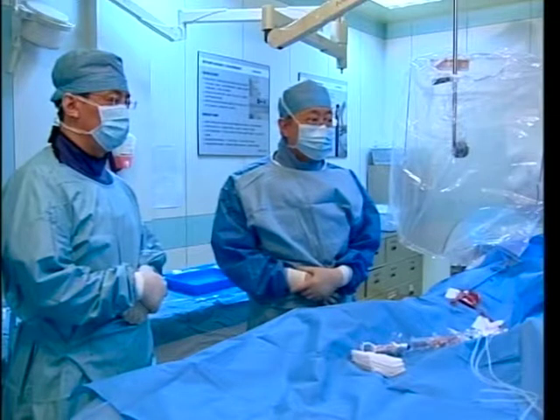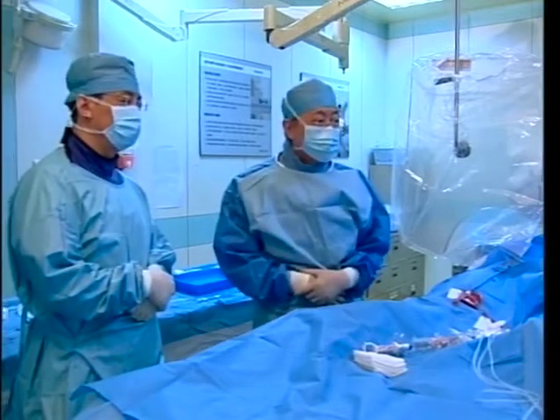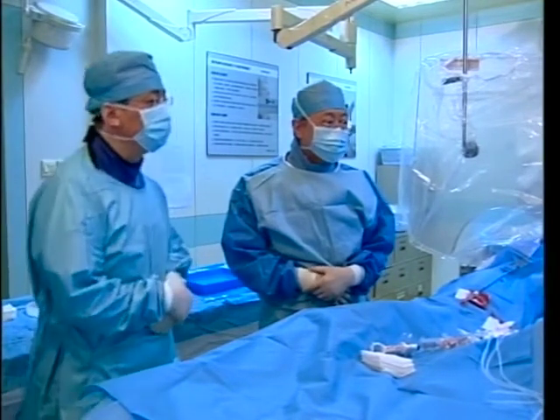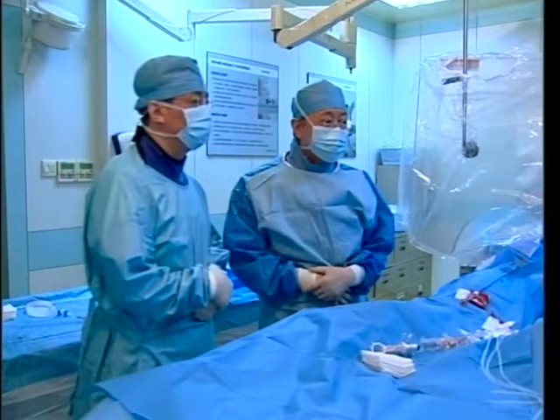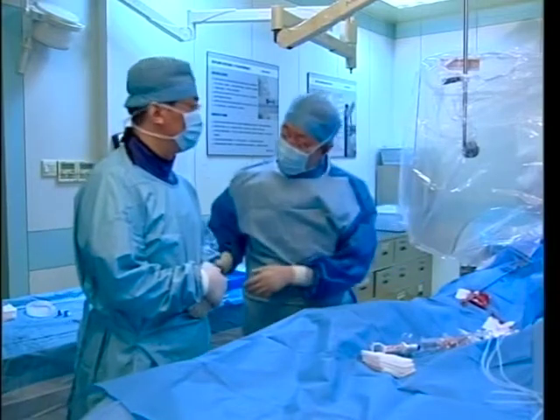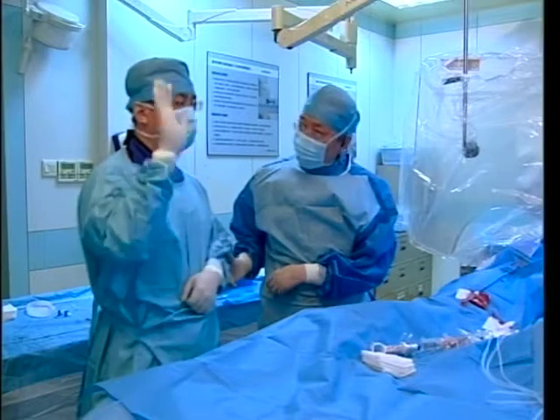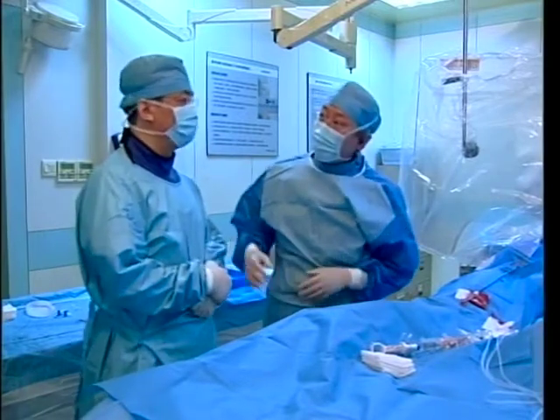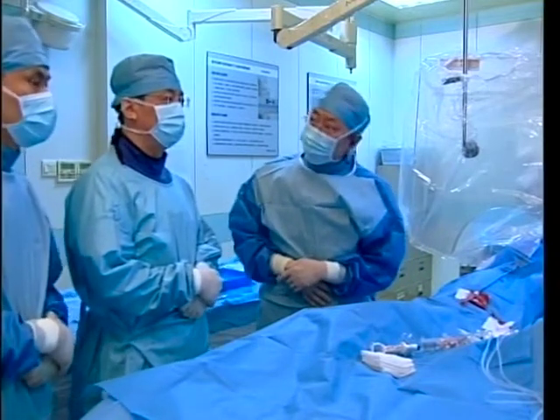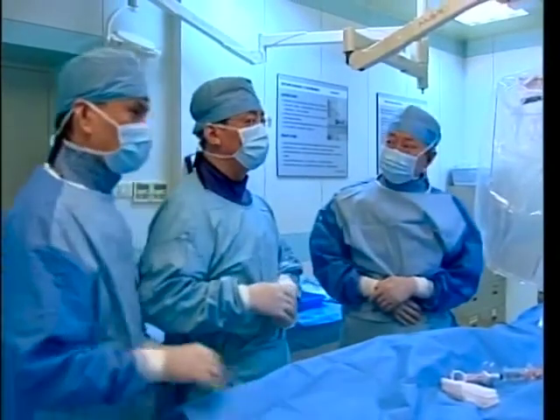Hello, Dr. Feldman here, Dr. Park? Yes. So can you tell us about your patient and the procedure you're planning? Can you see us? We see you and we hear you. On my right side, Professor Yao, and on this side, Dr. Tin. Dr. Tin will introduce the patient. Okay, let me do it.